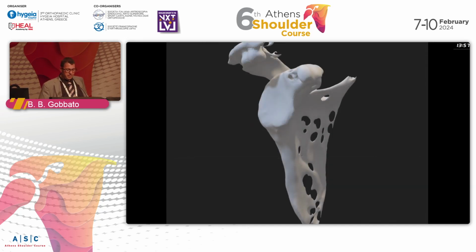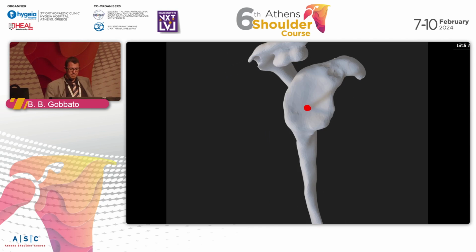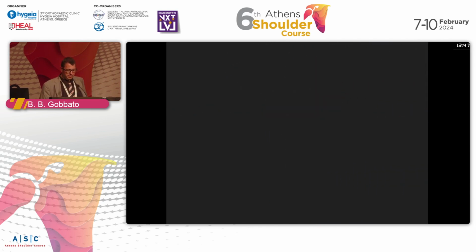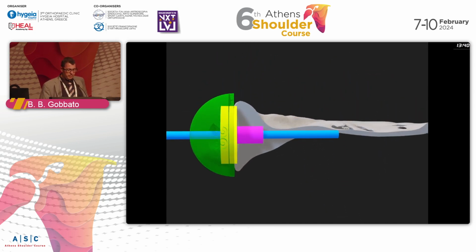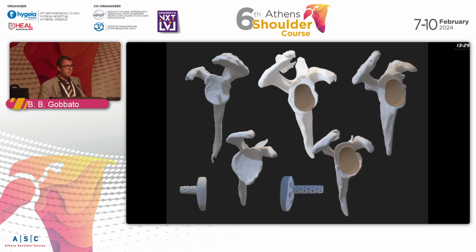Okay. Well, when you have a glenoid like that, you put the guide in the middle of the glenoid. It will be right in the middle of the glenoid, and the implant will be correctly positioned. And for that, we just don't need to use the force. But we are not the same. We see lots of different patients, so we cannot use the same implant for every patient, okay?